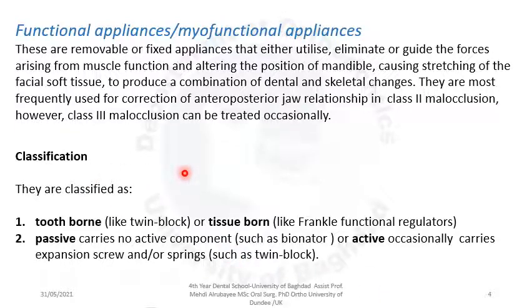Classification of myofunctional appliances. They are classified as tooth-borne, like the twin block, or tissue-borne, like the Frankel appliance or Frankel regulator. Passive, which carries no active component, such as the bionator, or active, which occasionally carries expansion screws and or springs, such as the twin block.